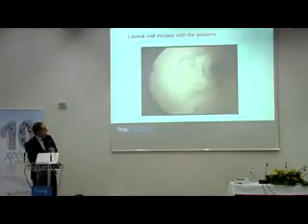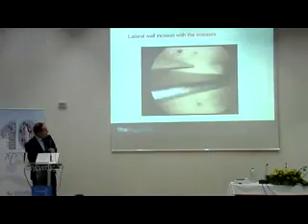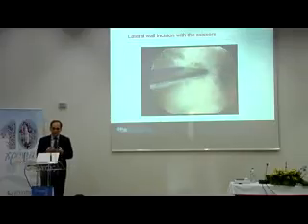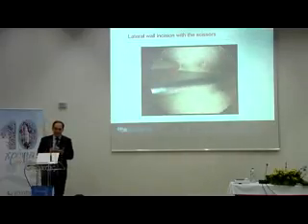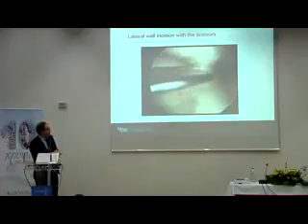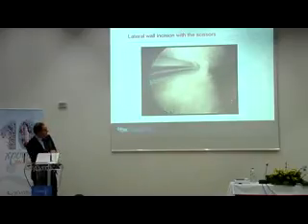So you see, under vision, you take a scissor and you look at the fibers. Normally, there should be blood, because this is the womb. There you need implantation. You need a healthy vascularization for implantation, and it is not there.